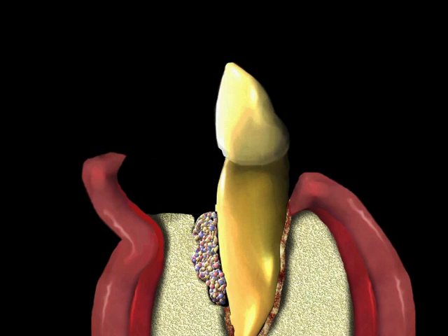In an effort to get bone fill at the time of surgery, a bone graft can be performed. The material used in such a bone graft can be from a variety of sources. In some cases, it can be taken from an area adjacent to the bone defect. If no bone is available, it can be obtained from a bone tissue bank, or it can be a synthetic bone graft material. If bone is from a tissue bank, such material is freeze-dried, demineralized bone that is sterilized and does not need to be tissue matched, since there is no identifying protein.